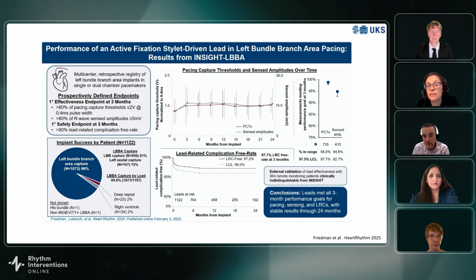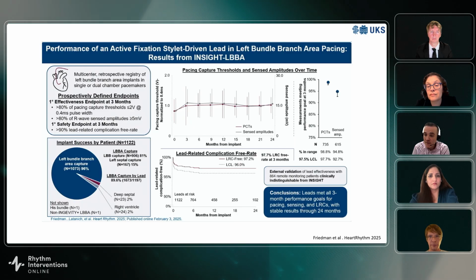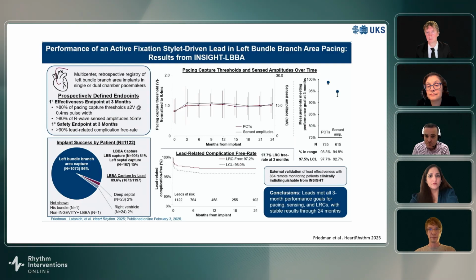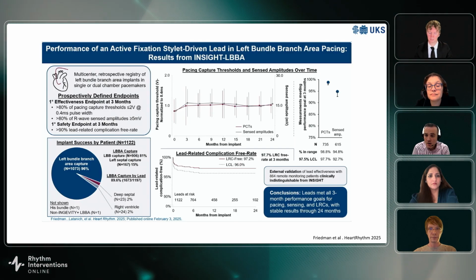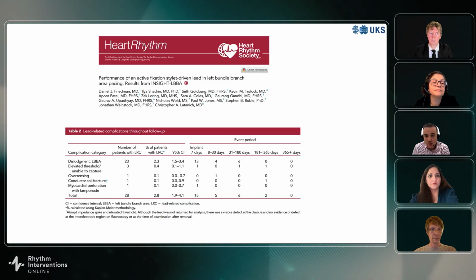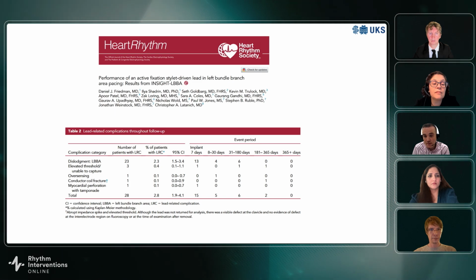Here we can see the lead-related complication-free rate, and this was 97.2%. Talking about basic metrics, the threshold was stable during follow-up, and the same for R wave amplitude. Complication is really very important. Maybe we can talk about dislodgement, which was only 23 cases, and the majority of the dislodgements happened during the 7th day after implantation.